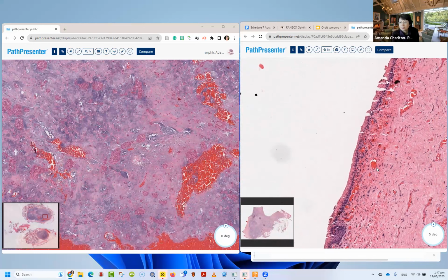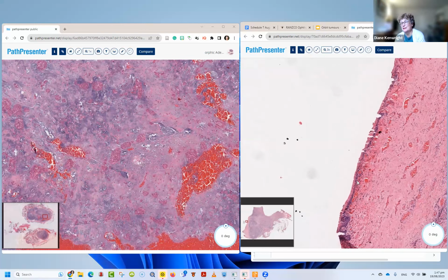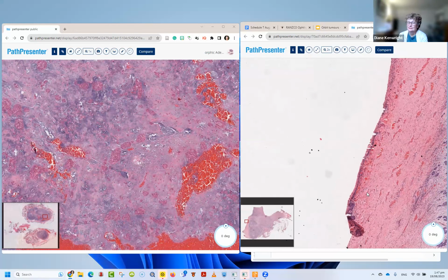But Diane's frozen. So are you still there? Diane's audio is not so good. Okay, so we've got a tumor. There's a lag. Shall I speak? Plotting an epithelial surface, haven't we? And then infiltrating something. Yeah. Oh, okay. You talk then, Amanda. Okay. Yeah, Diane keeps on breaking up.